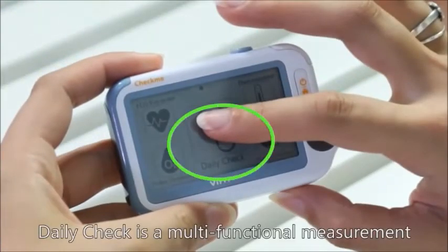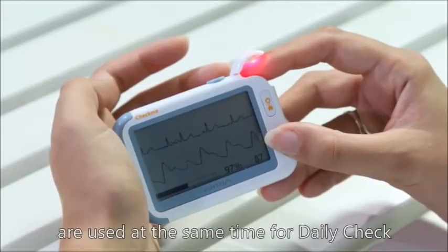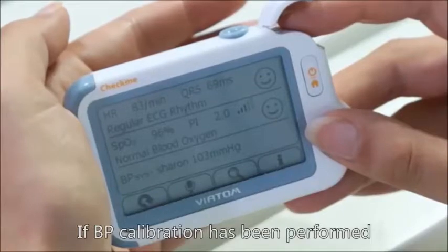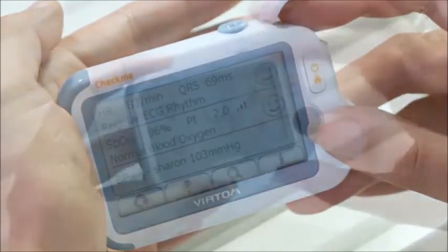Daily check is a multifunctional measurement. ECG electrodes and an SpO2 sensor are used at the same time for daily check. You can get ECG and SpO2 results at least. If a BP calibration has been performed, you can also get that of systolic blood pressure.